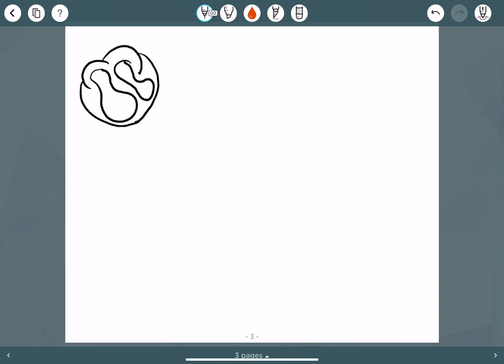But lead 2, you have your reference electrode kind of up here and your exploring electrode down in this direction. So you're recording through the heart. This is kind of the direction of lead 2.